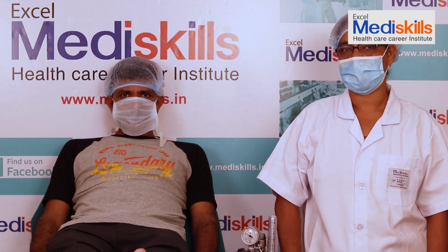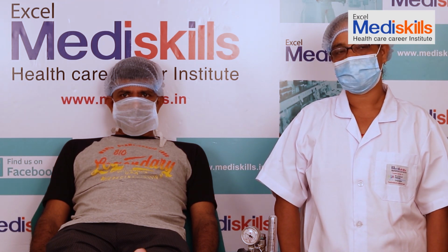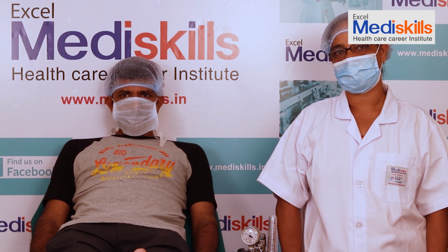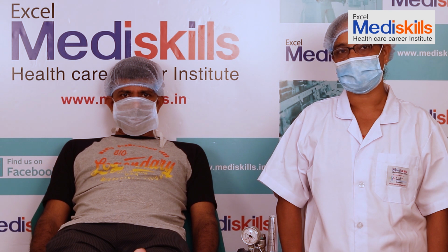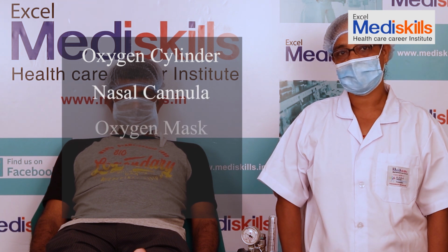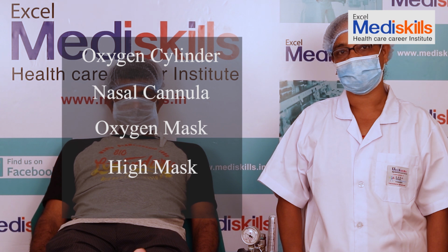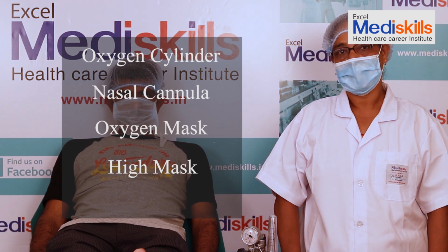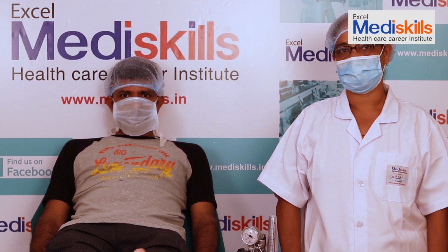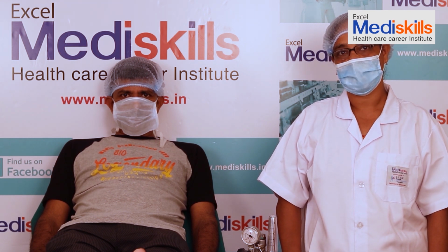Why do we give oxygen to a patient and what is required to give oxygen to a patient? When a patient is suffering from a breathing problem and is admitted to a hospital or nursing home, then oxygen is given. What are the tools needed for giving oxygen? An oxygen cylinder, nasal cannula, oxygen mask, high mask, and for humidifying oxygen, a humidifier. Generally, a patient is given oxygen with this equipment.